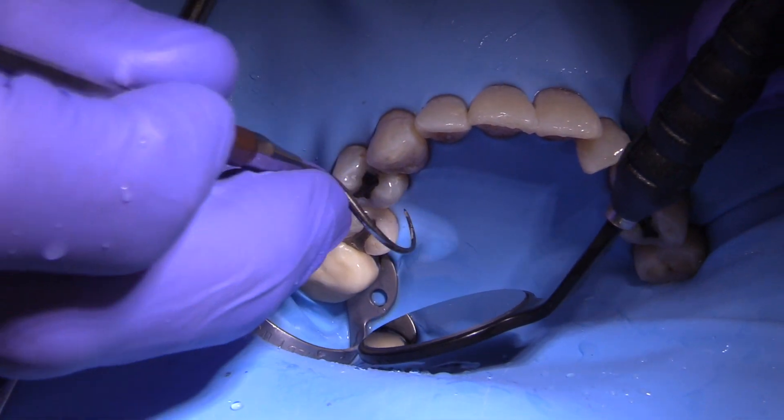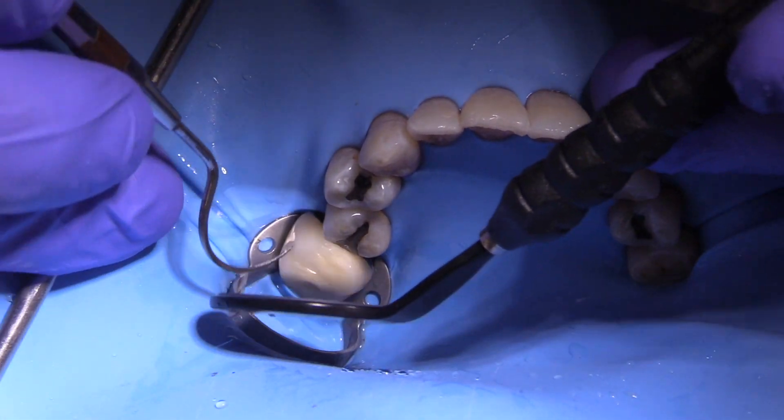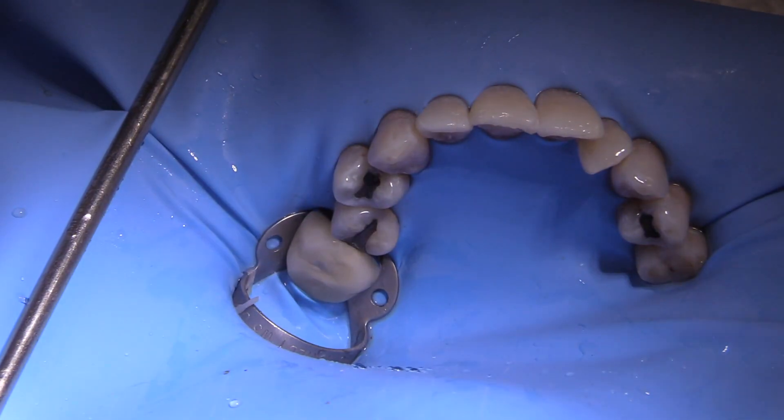Sometimes you may even need to put a little hole in the rubber dam in the middle so that the patient can breathe. But it doesn't have to be a very large hole — a little small hole is plenty for patients to breathe.